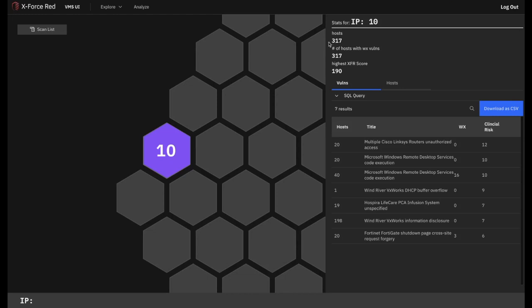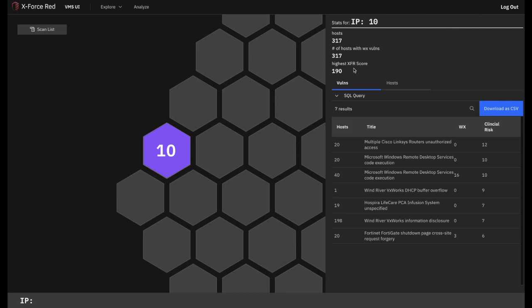When we click on the hex, a treasure trove of information appears. In this network, there are 317 assets and 317 vulnerabilities, a one-to-one ratio for this dummy data set. We see the highest XFR score, which is the same as the combined score we saw in the explore menu, derived from a combination of VMS technical analytics and CCOM² scores based on clinical, organizational, and regulatory metrics. In this network, the highest score is 190. Next, we have two tabs for vulnerabilities and hosts.